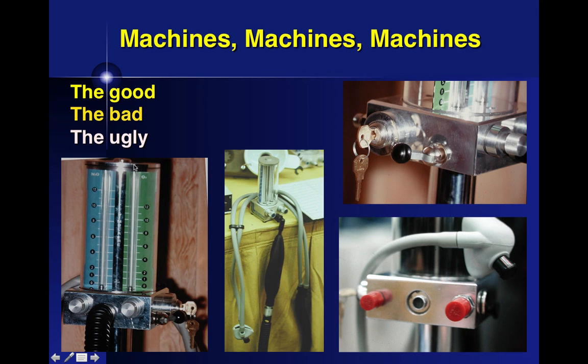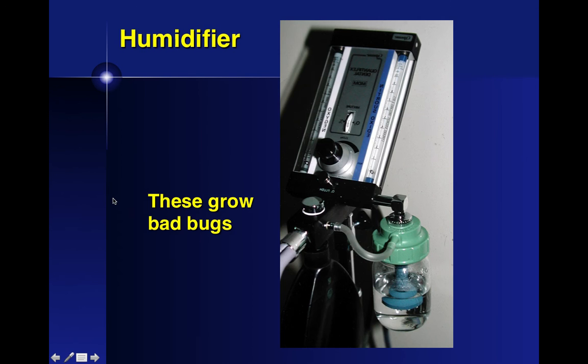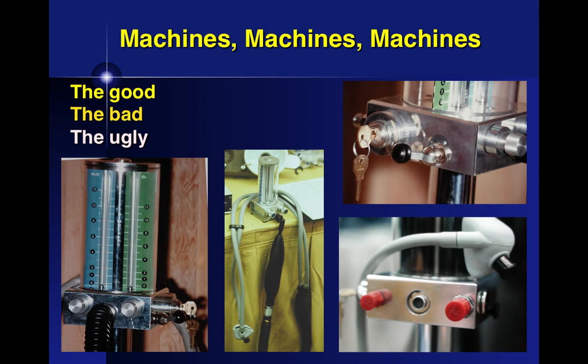So they had this plastic canister. When the patient inhaled, they brought air in through this valve into the plastic canister and they breathed out whatever gas was in the canister. Then while they were resting between breaths, the canister would again get some more gas in it. So that time when they breathed in, they got some of what was in the gas and some room air that was also in the canister. So it was a bad design and it went away.